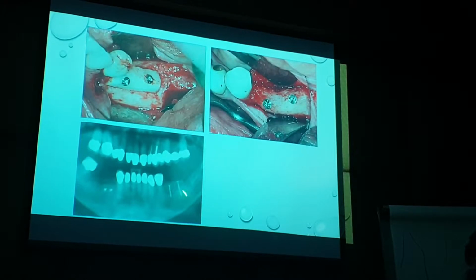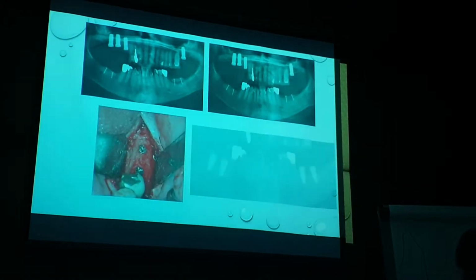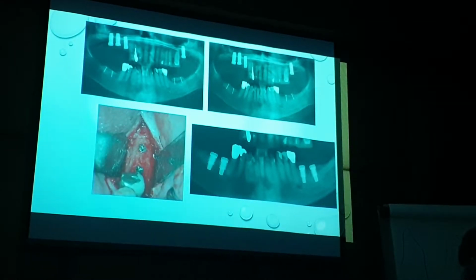And that's what it is, fully incorporated. So it looks like with the 2 bolt screws in place, and then drilling our osteotomies for our final implants. Again, just going through the case real quickly, and the implants in place bilaterally.